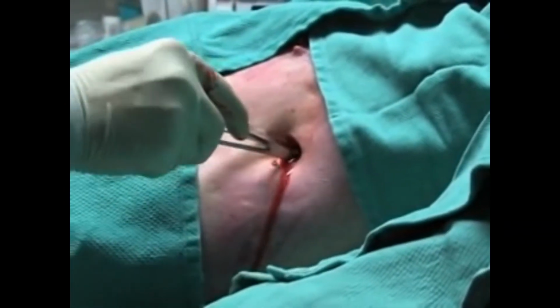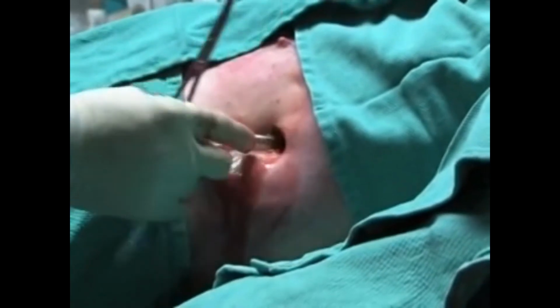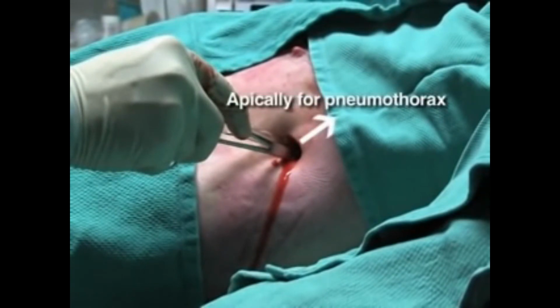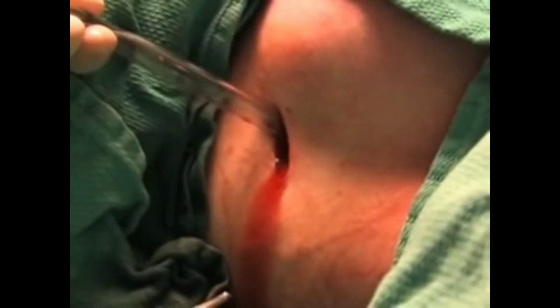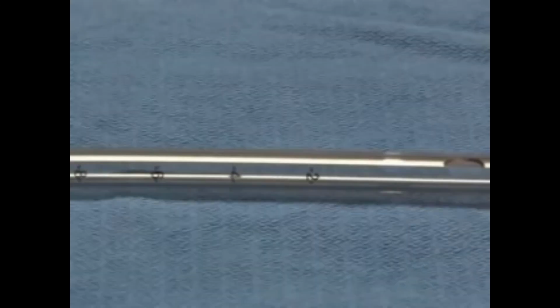Advance the chest tube into the incision and unclamp the proximal end, then direct the tube slowly, either apically for pneumothorax or inferiorly and posteriorly for pleural effusion. Make note of the depth the tube has passed by keeping track of the numerical markings on the side of the tube. Make sure that all drainage holes are inside the chest cavity to provide adequate seal and to prevent leakage.